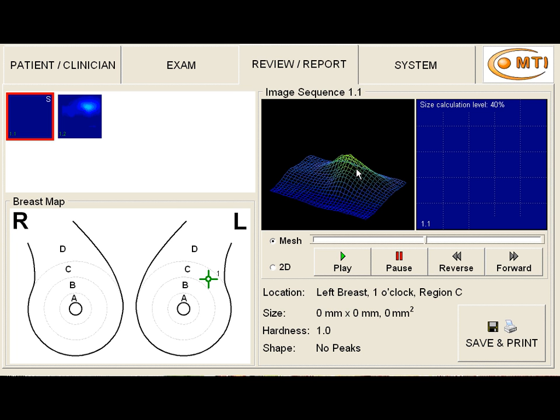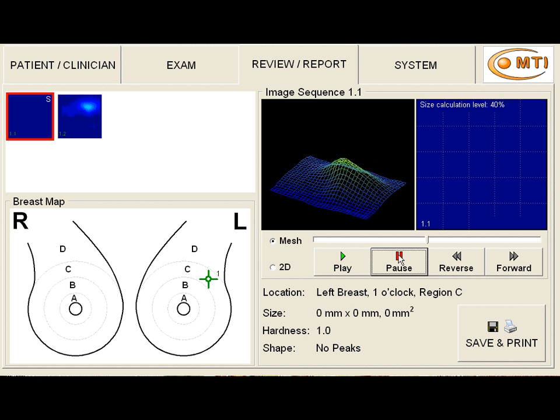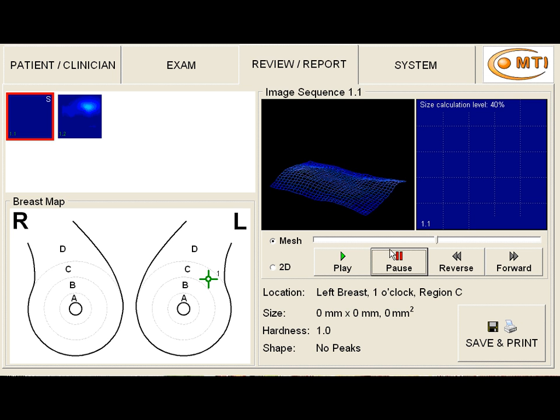This is not a real mass because it doesn't persist. We examine back and forth and back and forth in this area. And only at one time, at the change of direction, did we see a slightly larger mass. And so this is consistent with an artifact. And as we follow it through, again, we don't see it again. What's more important to note is the multiple small waves that are coming through here.